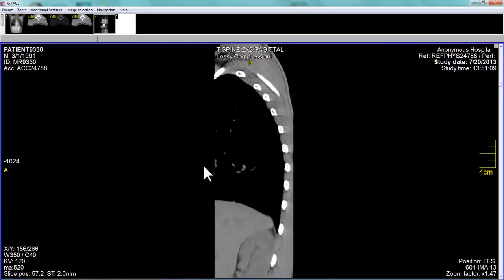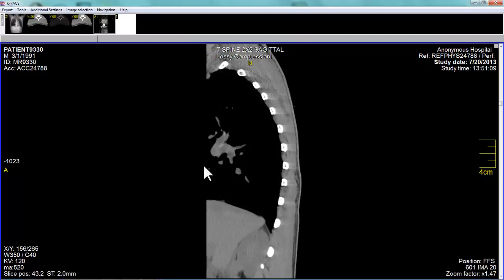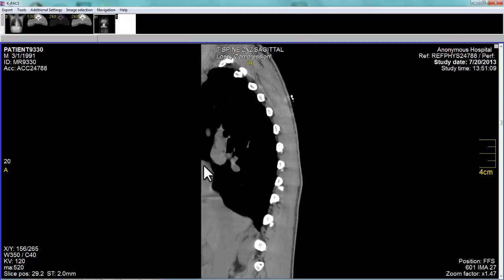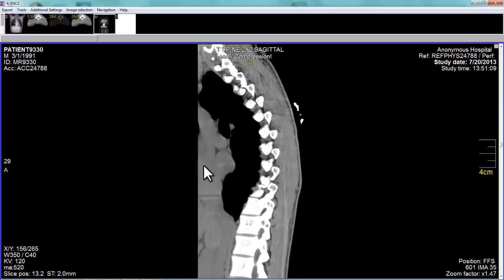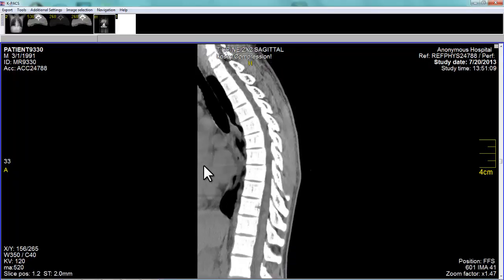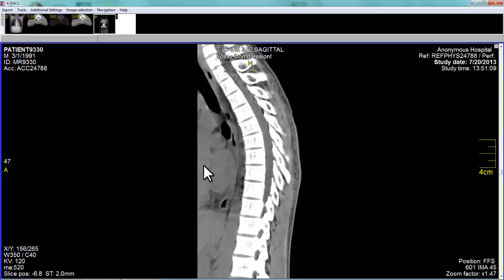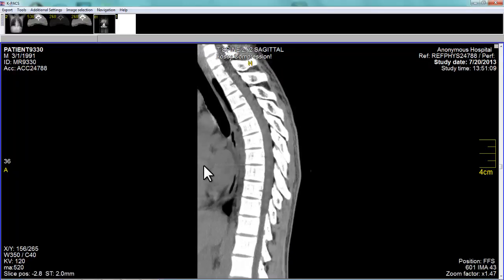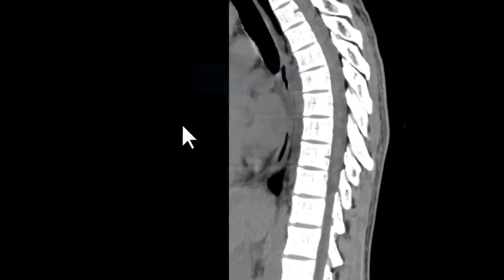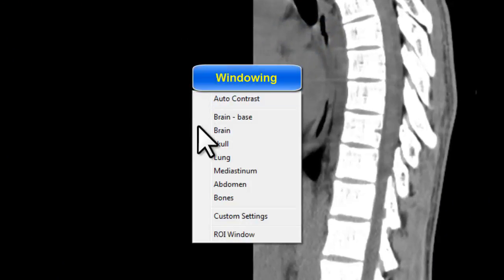I'm scrolling now to get to the midline. We're at midline now, and I'm going to change to the bone windows.